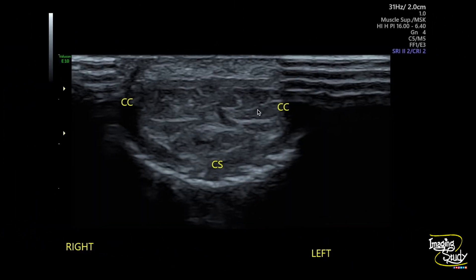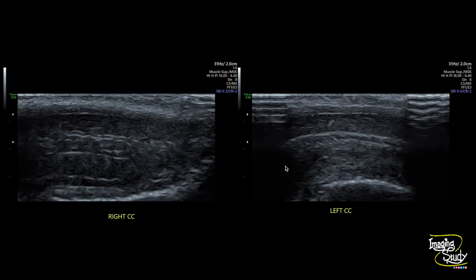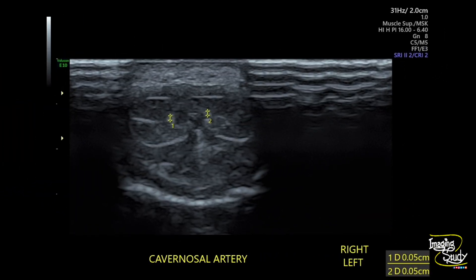Here is another picture. You can see the corpus cavernosa and corpus spongiosum in transverse sections. This is the longitudinal section of the corpus cavernosa. The echogenic walls of the cavernosal artery are visualized here. There are no definite calcific or fibrous plaques present. We have measured the cavernosal arteries and they are around 0.5 mm in diameter.